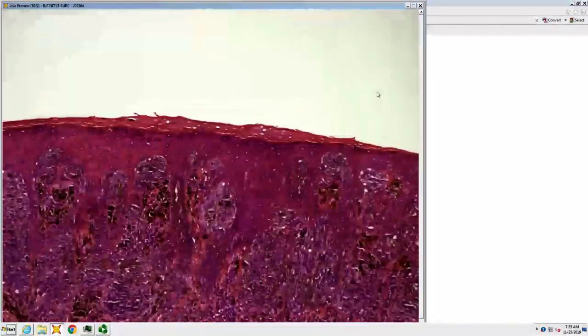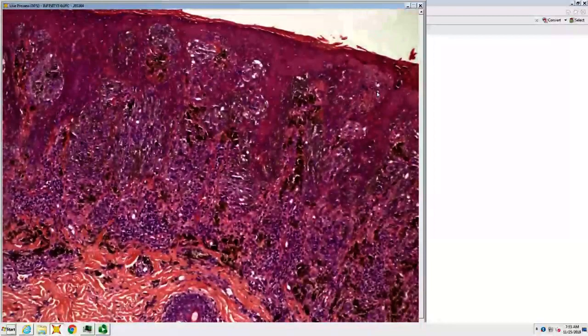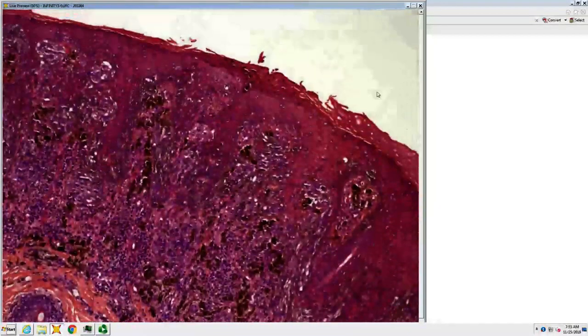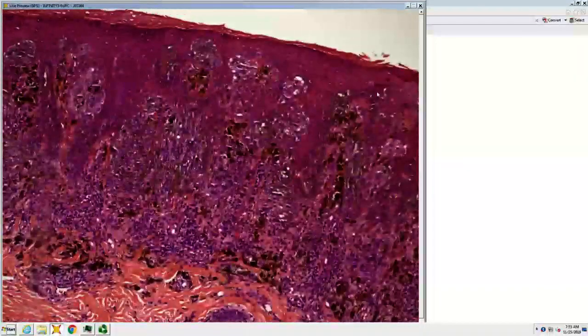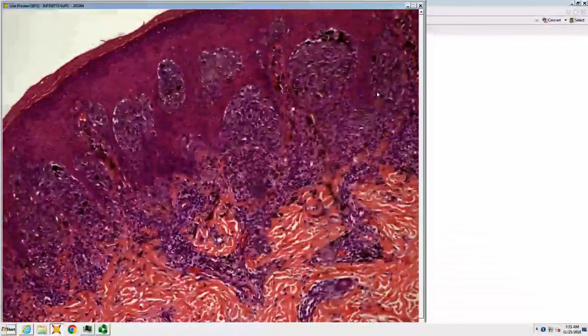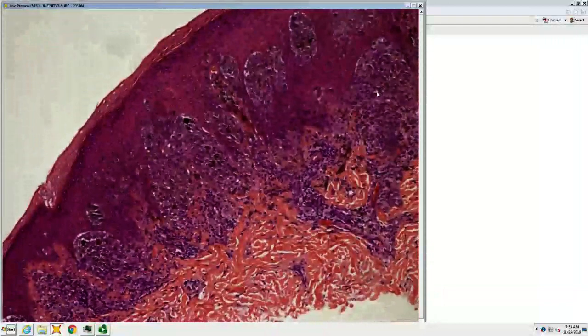This looks like a Spitz. Or pigmented spindle cell nevus. So whether or not you regard that as a subtype of Spitz. Spitz would have larger spindle and epithelioid cells. Pigmented spindle cell nevus tends to be proximal extremities, usually young women, usually eruptive, quite dark. Small spindle cells and unique mutations. But it does look spitzoid.